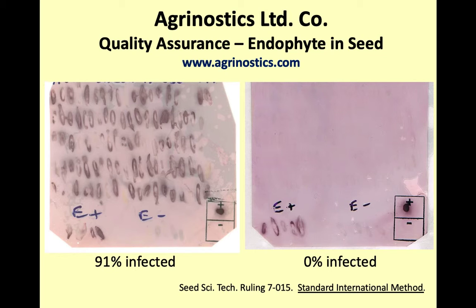We just put seed on a membrane and we extract the things that the antibody detects on that little membrane right there. It's not all that sophisticated a demonstration, but it's to show you how simple it is. Then we go through a series of solutions that have some different reagents in them. And when we have endophyte presence, we see something that looks like this.